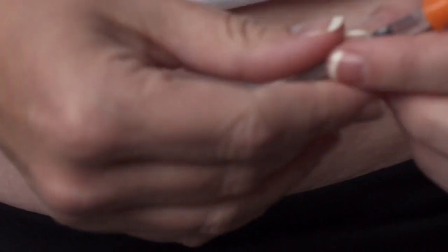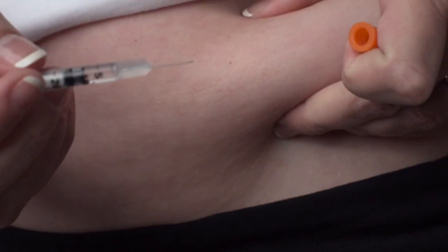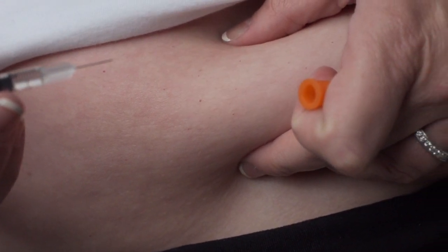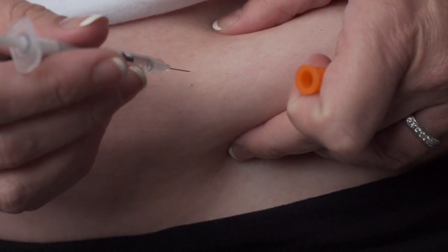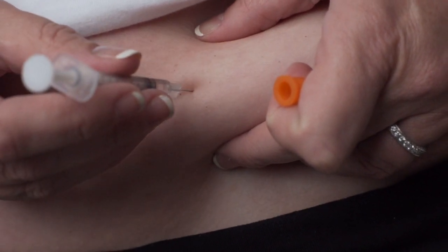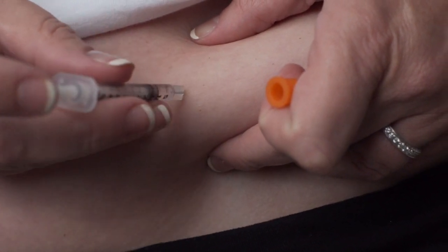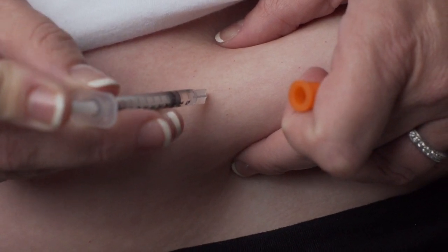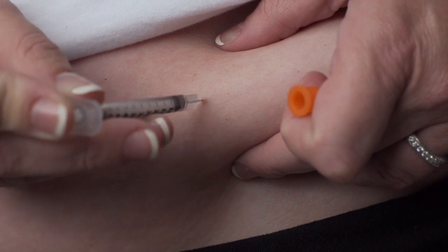Hold the syringe in your hand like a pen or pencil. With the other hand, gently grasp a small fold of skin between your thumb and index finger at the injection site. Insert the entire length of the needle into the fold of skin at a 45 to 90 degree angle. Once the needle is inserted, release the pinched skin and push the plunger in a slow, steady motion until all the medication is injected.